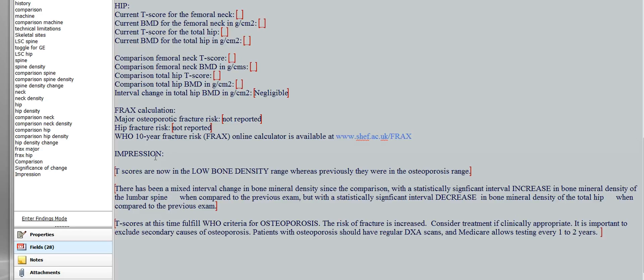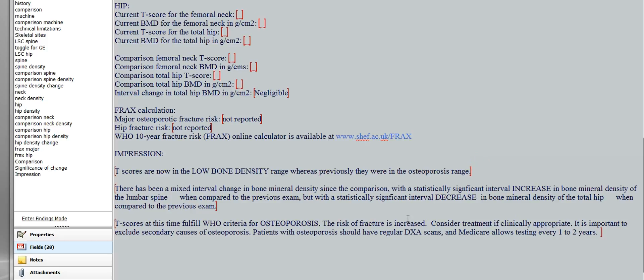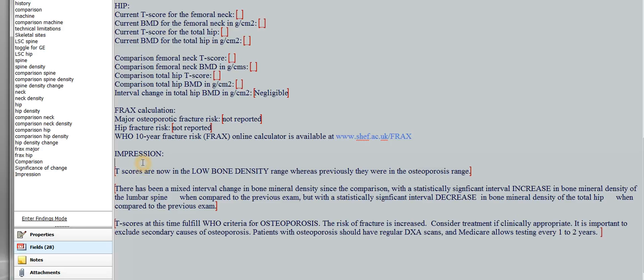So for this template, there are three separate impressions. The first one is sort of a general comparison of the WHO category. What was it? What is it? Sort of what was the state, what the patient was, and what are they now? The second one is a detailed discussion of whether interval change is statistically significant or not. And the third one is just the current state of affairs. What does the patient have, and what do we need to do about it? So let me look at each of these in detail.